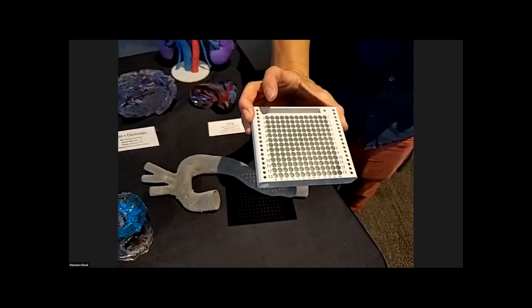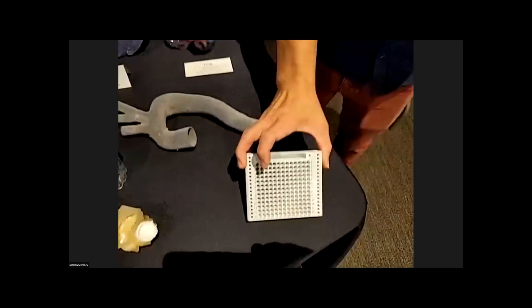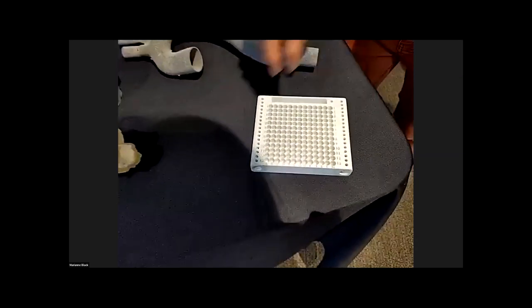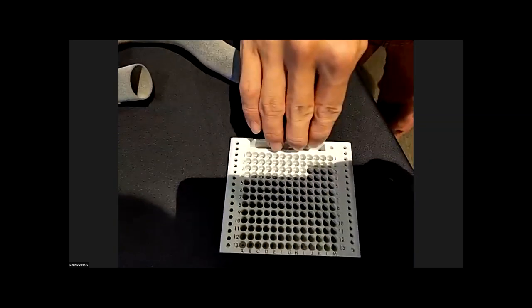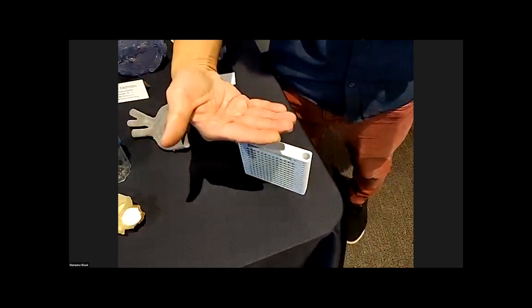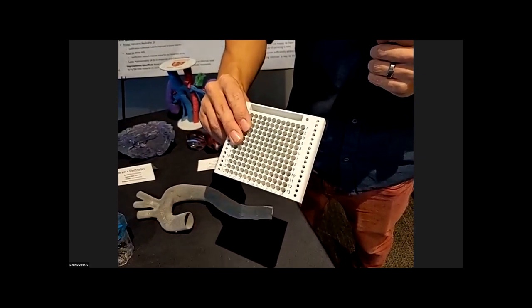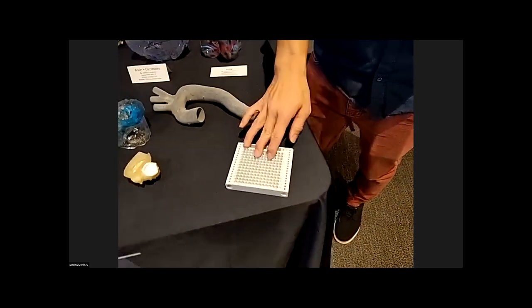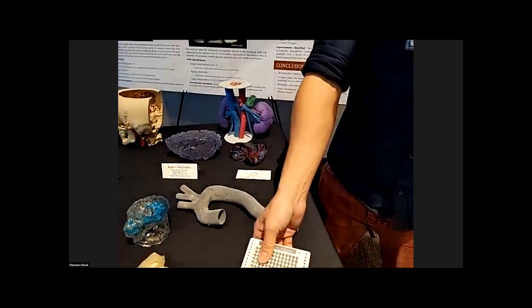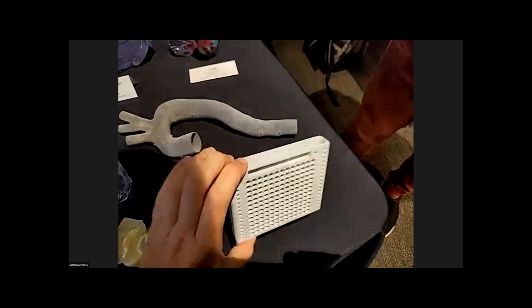So this one is a cryoablation grid, also one of our clinicians' research projects. Prostate cryoablation. There's a little shelf that goes here, and this is positioned right below the scrotum to help the surgeons better aim their cryoablation needle. It's used in MR, so it can't be metal. It has to be some non-metallic material. Is that visible in an MR scan? Yes. That's neat.